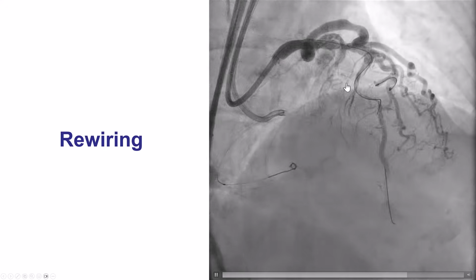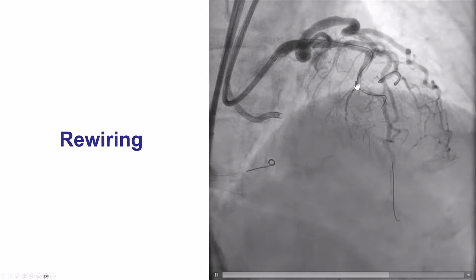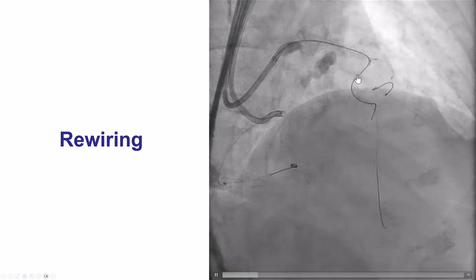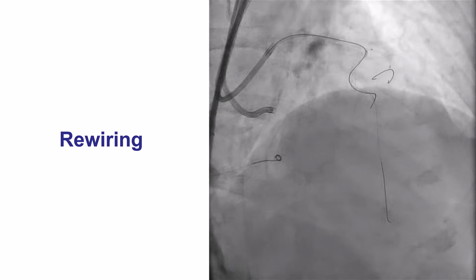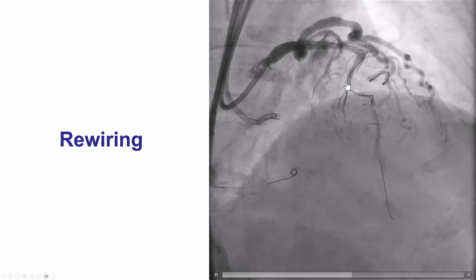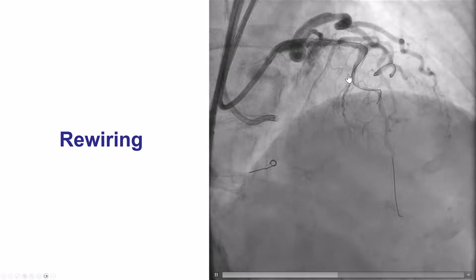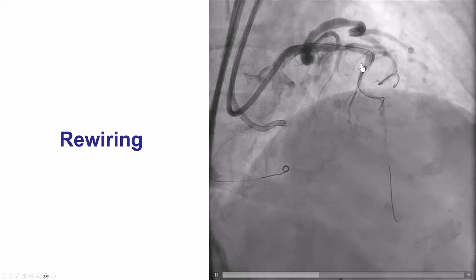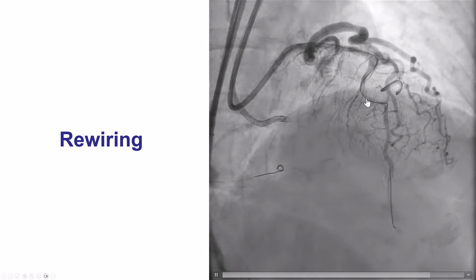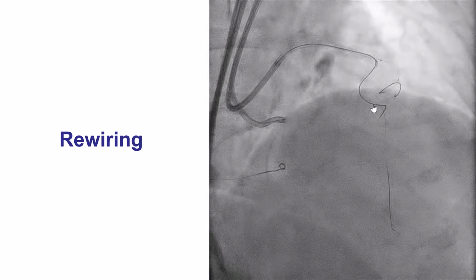When we look carefully at the course of the wire, it looks like the wire might have gone outside the stent in this distal portion of the stent, and that was probably why the microcatheters and the balloons would not go. And we tried not only microcatheters, but also Sapphires and Takeru balloons, and those would not go either. So it may be outside the previously placed stent, so we tried with another guide wire to advance in a different plane, but unfortunately we were unable to do so.